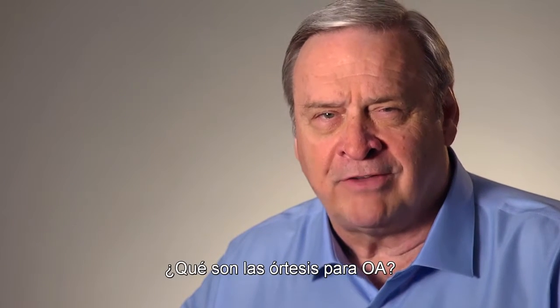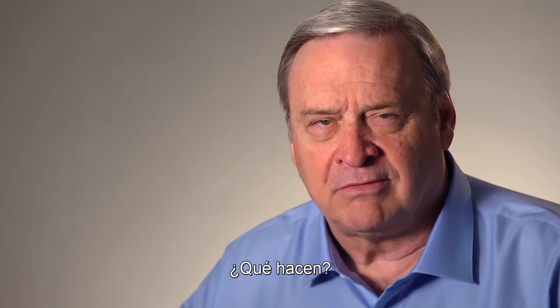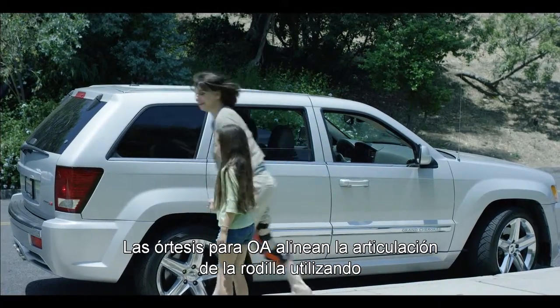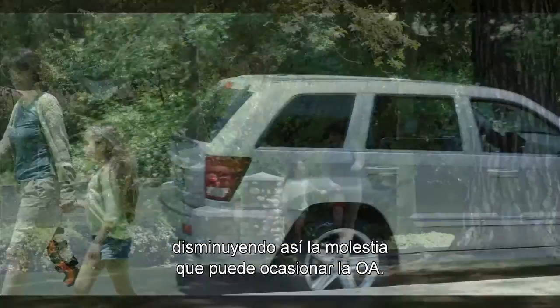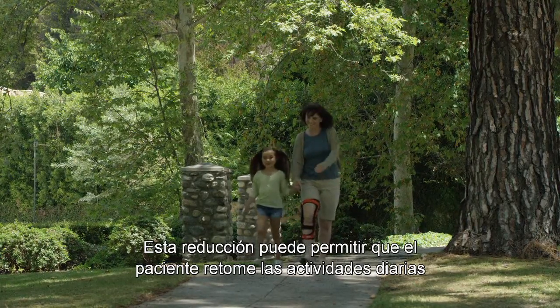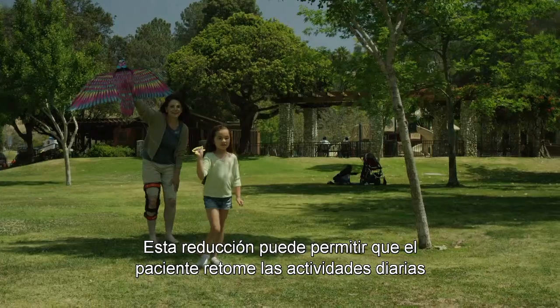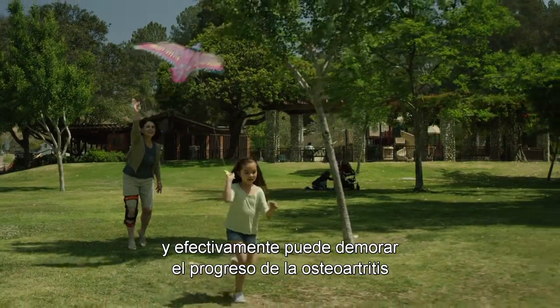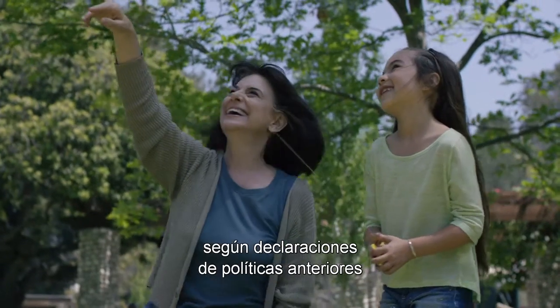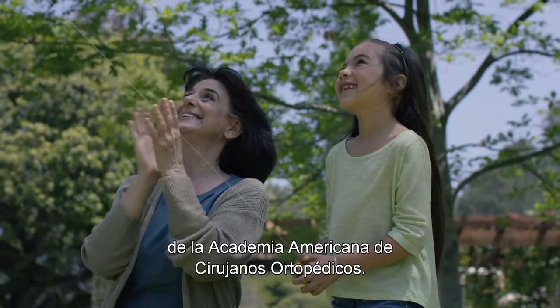So what is OA bracing? What does it do? First, OA braces use corrective forces to align the knee joint, reducing the discomfort that can be caused by OA. This reduction can allow the patient to return to activities of daily living and can actually slow the progression of osteoarthritis, according to prior policy statements of the American Academy of Orthopedic Surgeons.